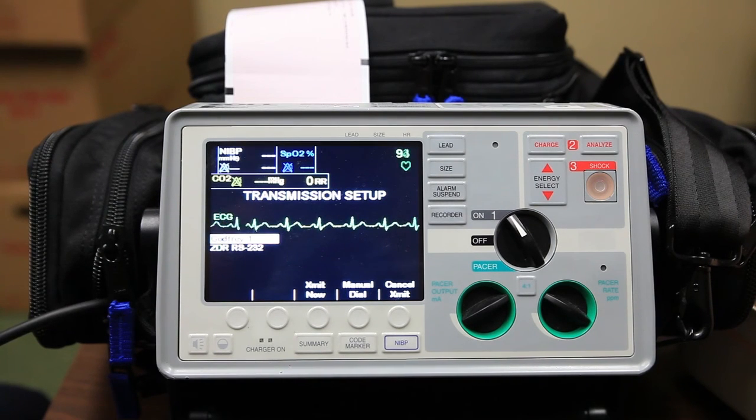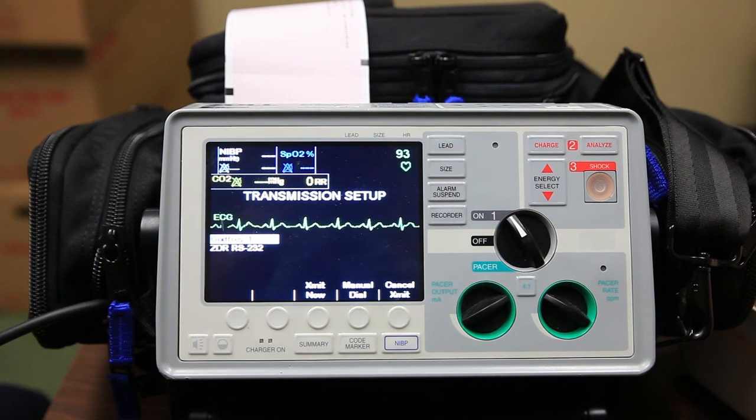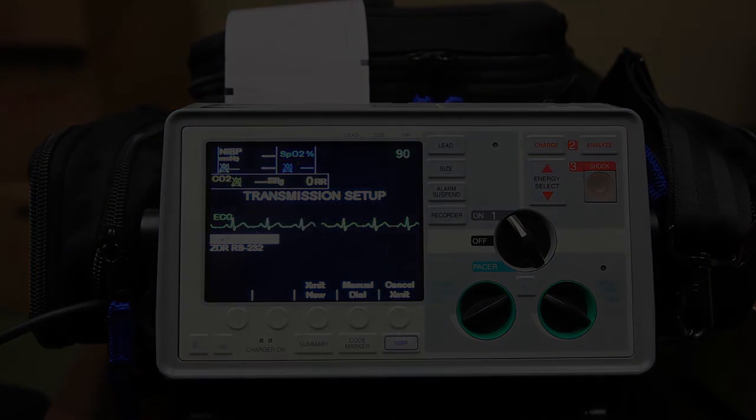We won't diagnose or interpret the rhythm at all since we're still a BLS agency. That's the basic 12-lead acquisition for the Zoll cardiac monitor. Thank you.